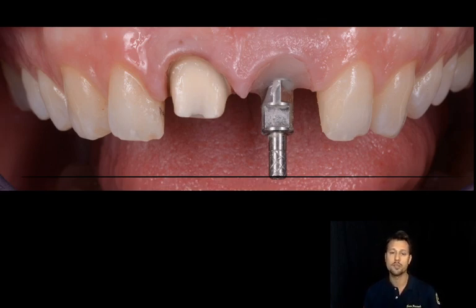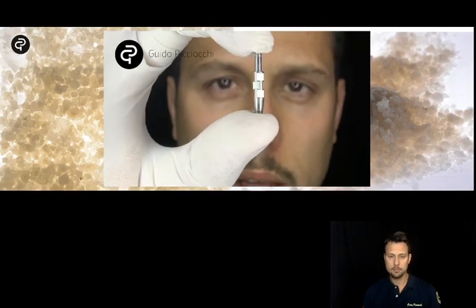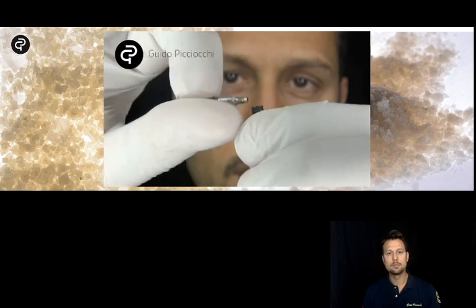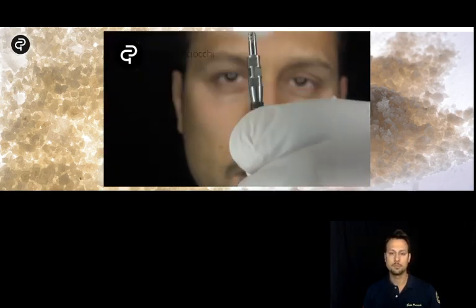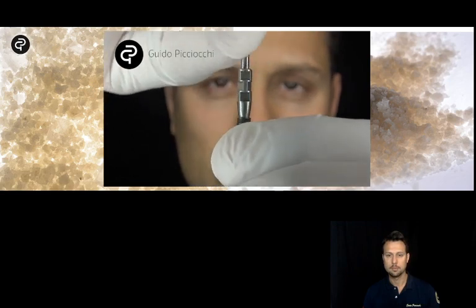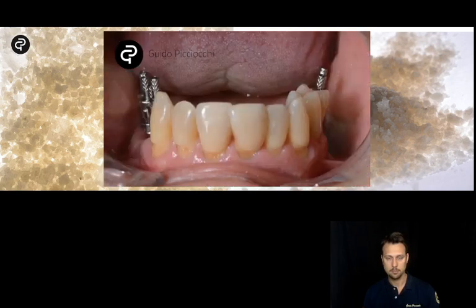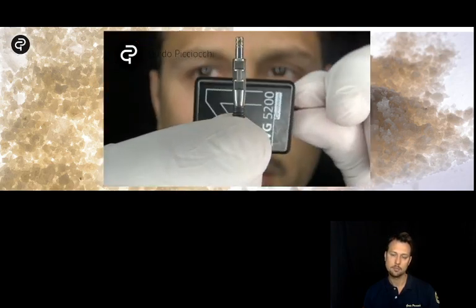We usually use what we call a transfer, which should be locked into the implant and screwed to the end. For a good impression, we need no rotation of them and no contraction of the material. Don't forget to take an X-ray for control.